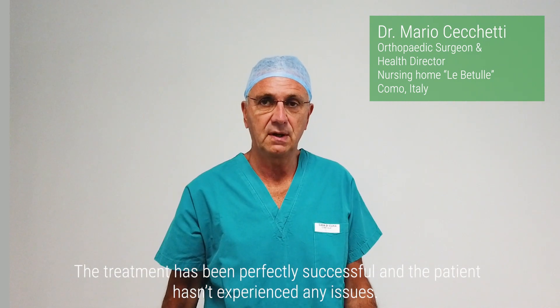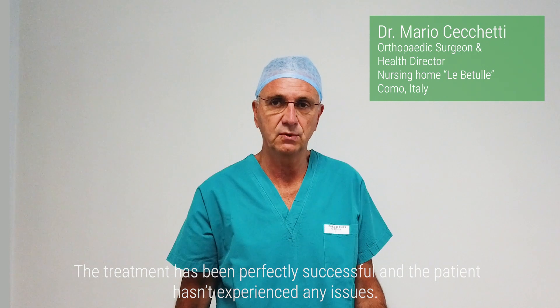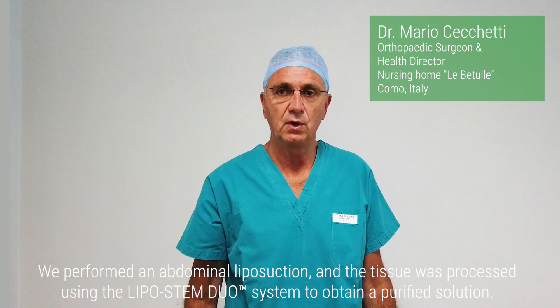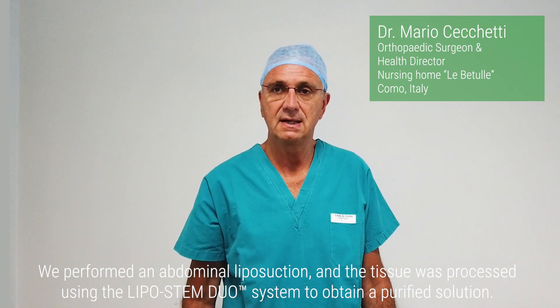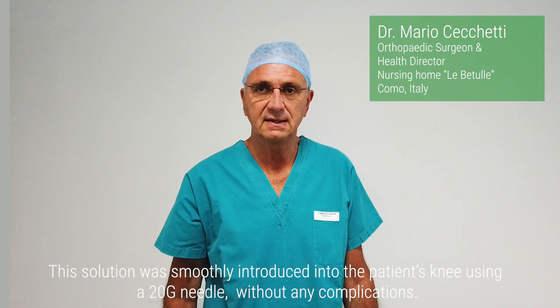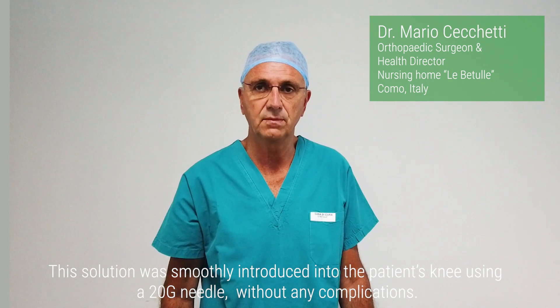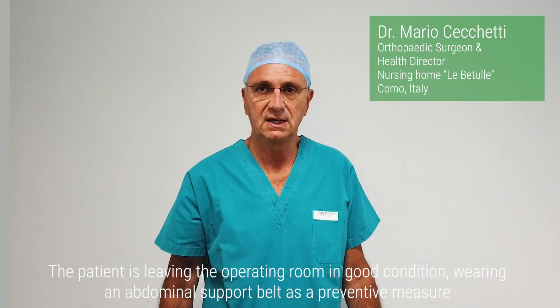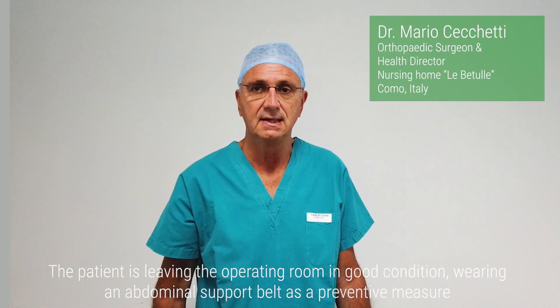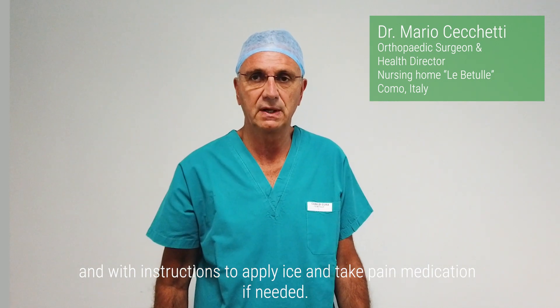The treatment has been perfectly successful, and the patient hasn't experienced any issues. We performed an abdominal liposuction and the tissue was processed using the Lipostem Duo system to obtain a purified solution. This solution was smoothly introduced into the patient's knee using a 20G needle, without any complications. The patient is leaving the operating room in good condition, wearing an abdominal support belt as a preventive measure and with instructions to apply ice and take pain medication if needed.